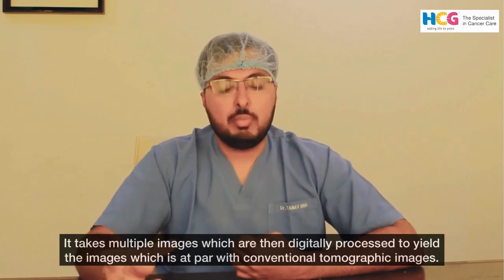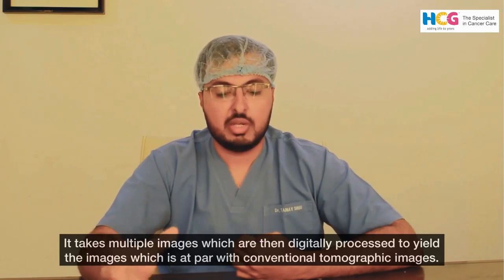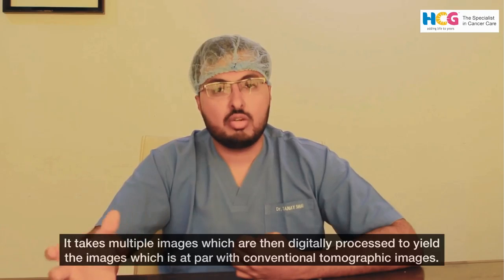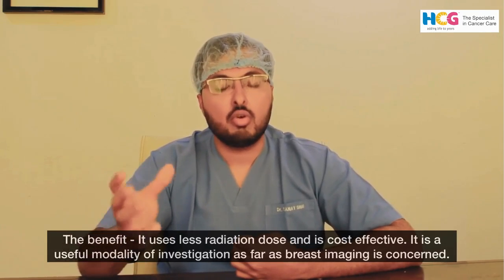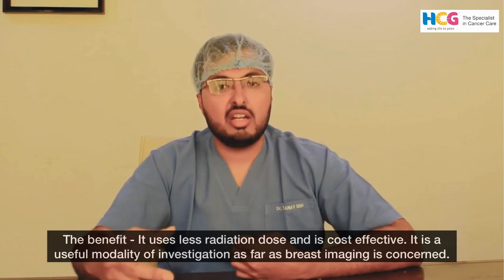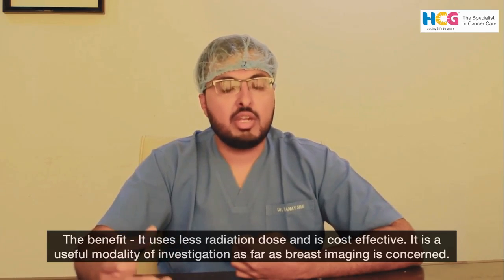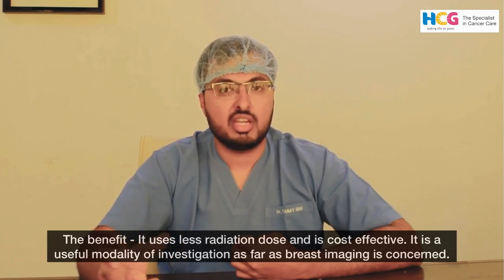It takes multiple images which are then digitally processed to yield images at par with conventional tomographic images. The benefit is that it involves much lower radiation dosage compared to conventional tomographic imaging, and it is also very cost effective for the patient. So it can be a very good and useful modality of investigation as far as breast imaging is concerned.